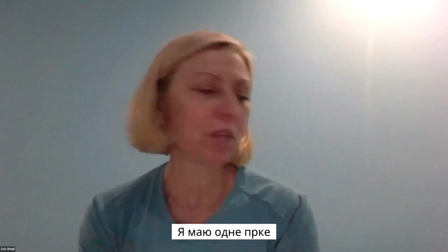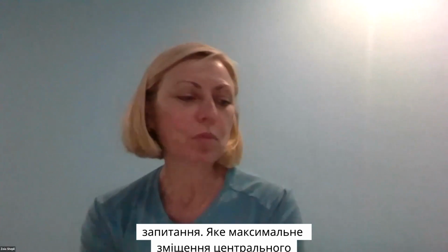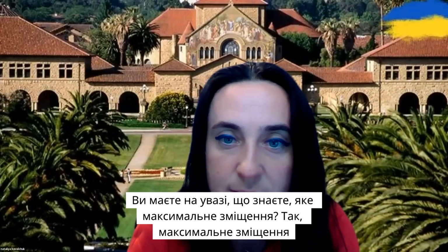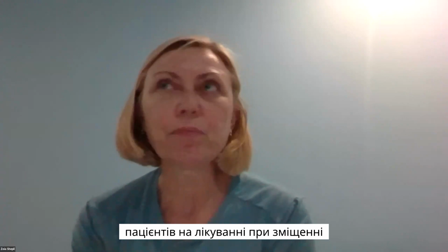Hello, I am Dr. Zoya Shepel from Kyiv. I have one maybe practical question. What's the maximum displacement of the central structures you accept for post-operative radiation therapy in your clinic? Because in our clinic, we take patients for treatment when displacement is less than 6 millimeters for central structures.